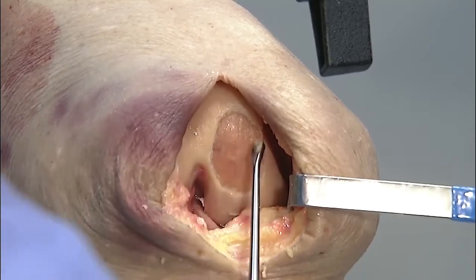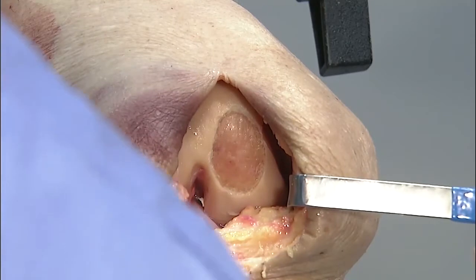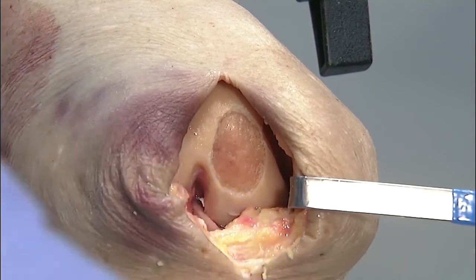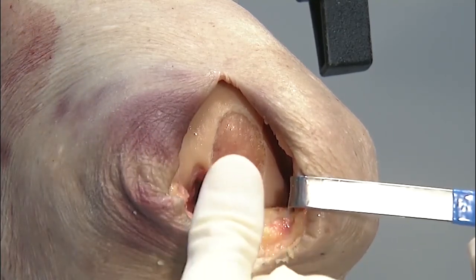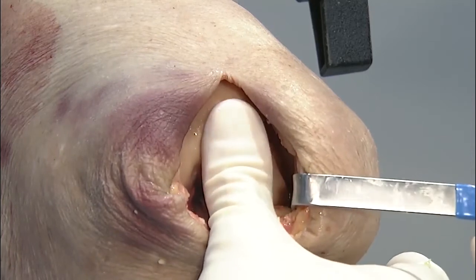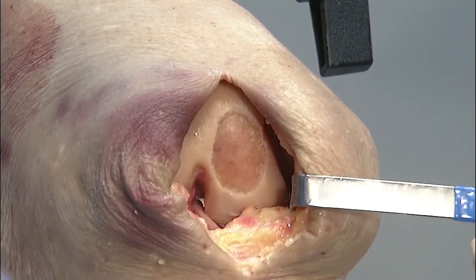Yeah. How's that looking, Adam? Is that about what you would do? It's awesome. It's better than I can do, which I expected. So then we basically have our preparation there. Typically in the operating room, if we had bleeding, this is the point where I would have my PA apply Fibrin Glue. He has a very large thumb, thankfully. And then he would hold that for 3 to 4 minutes while I'm preparing the graft.